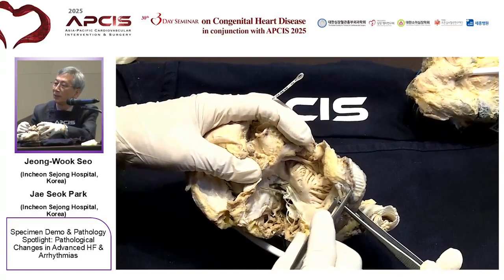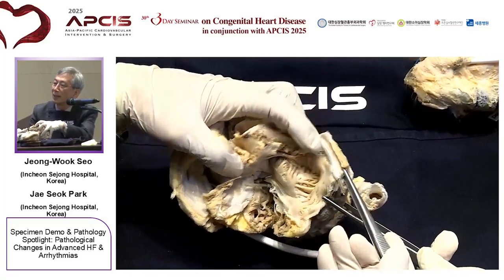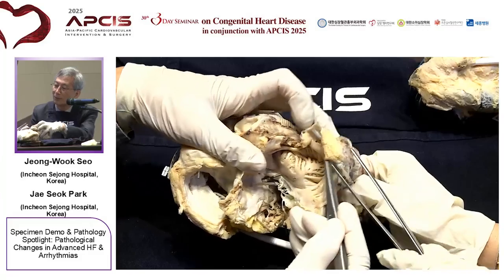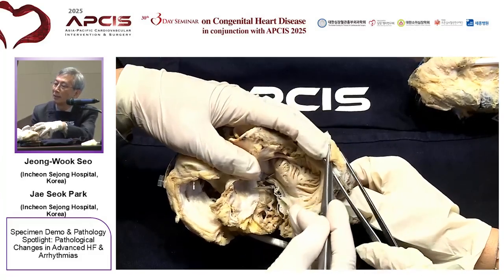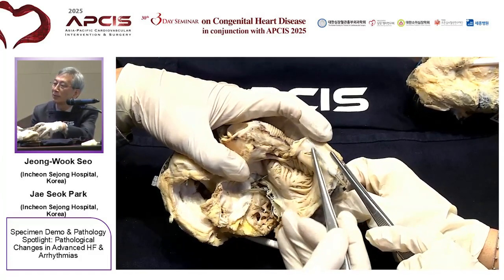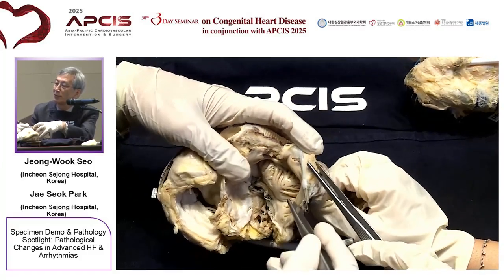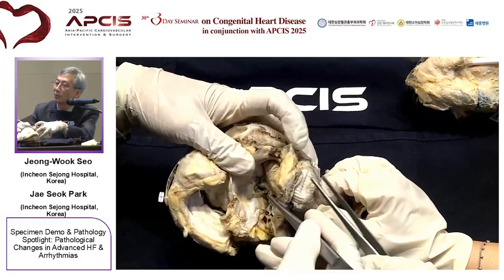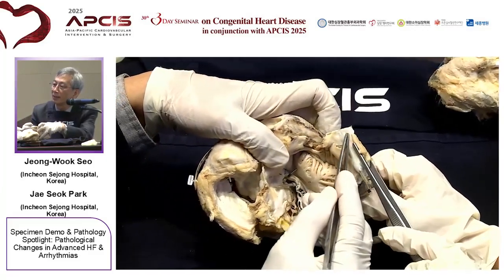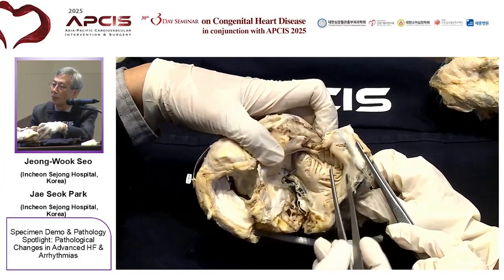And also there is a lead here that is embedded in the right atrial wall, and it is common after placing this lead that the endocardial growth covers it, going to the right ventricle. So with time passing, the catheter lead is embedded and fixed to the atrial wall.